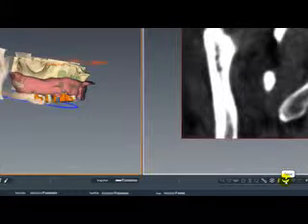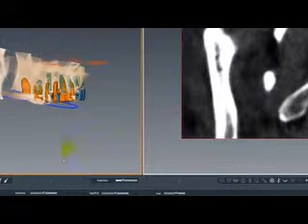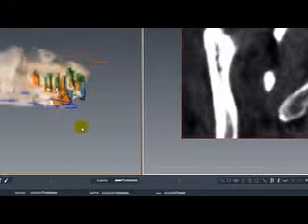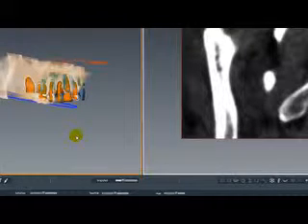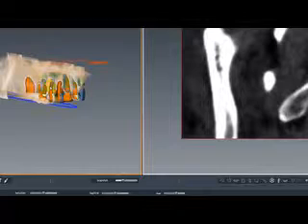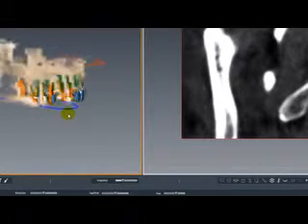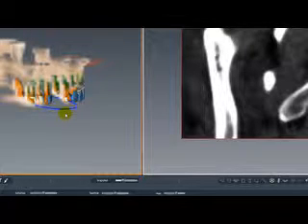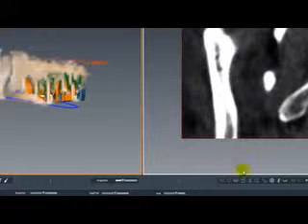I'm going to remove the tissue from here. Now I'm going to remove the bone, and I'll show you the right side as I have planned it. So on the right side, as I have planned it right here, I placed implants on tooth number 3, number 4, number 5, number 6, and number 8 as well. And I'll let you pick and choose in terms of what is the best ones to proceed. Of course, you will definitely need a sinus graft in there.